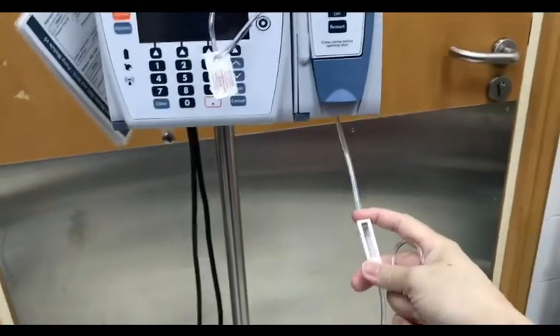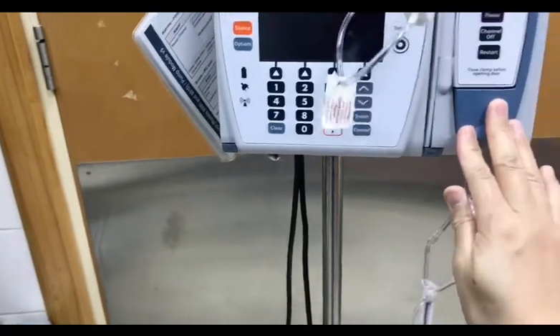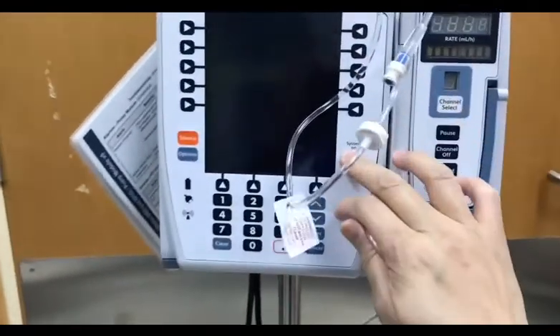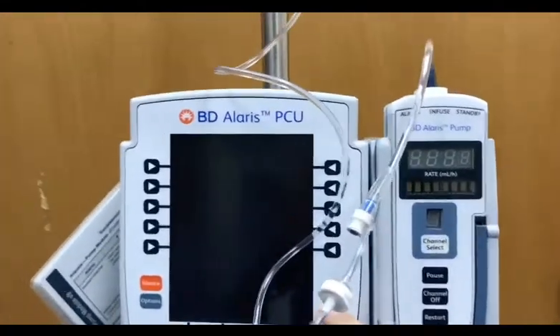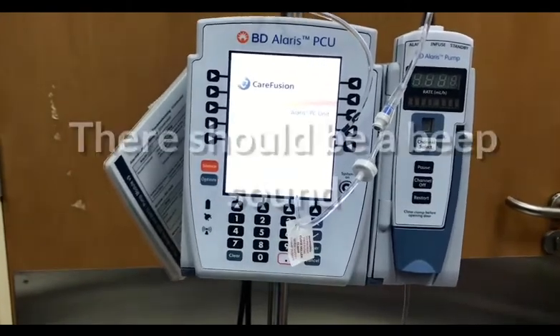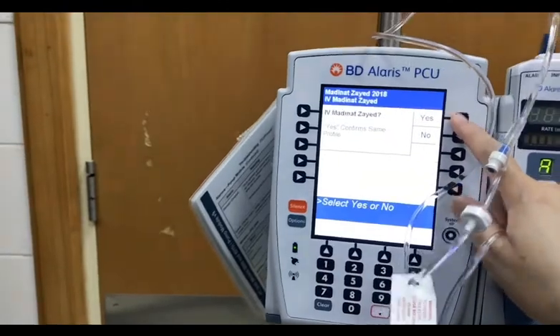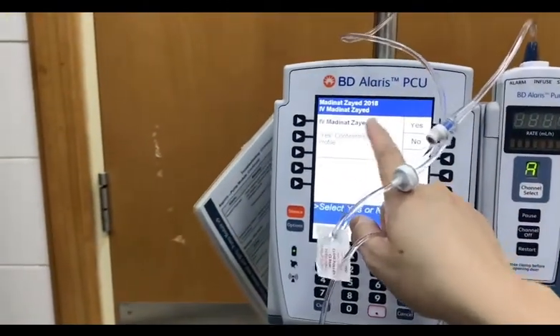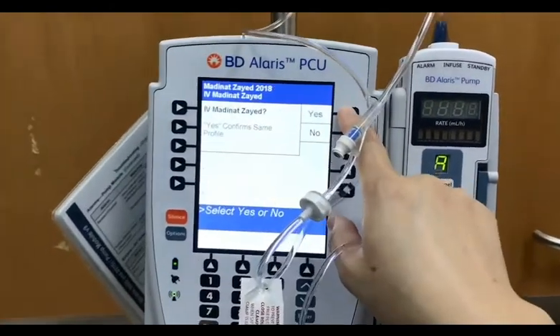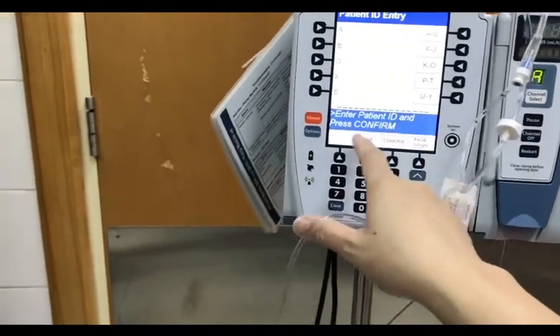And you should open this one. So, everything is open. The only control is inside. The machine now controls everything. So, switch on. System on. Once it's switch on, new patient, of course, yes. And the name of your hospital, because this is already pre-set up. We are in this hospital. Yes. And enter patient ID and press confirm.